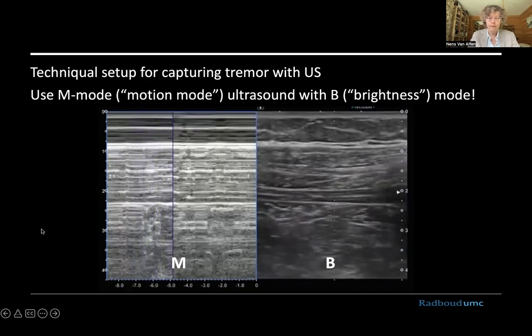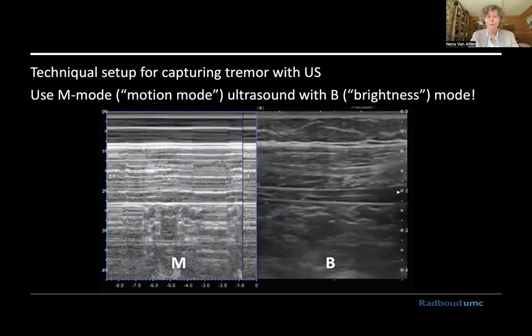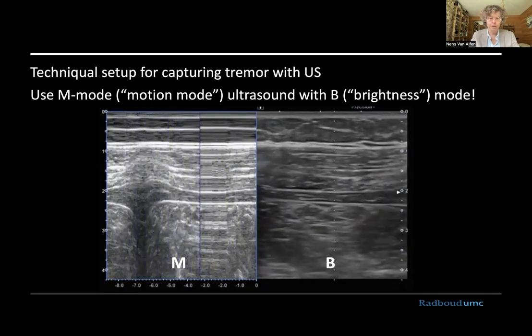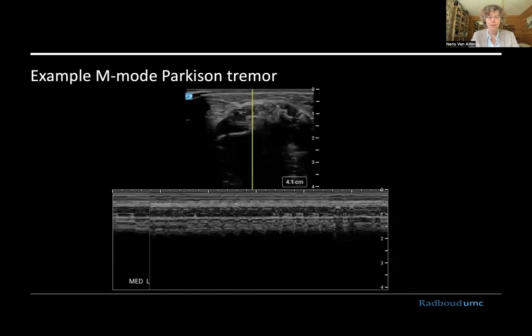Here are some measurements being performed, and we're going to see what that M line results in. So here again, you see the B mode image on the right, you see the M mode image, which is also called the beach with the sand, on the left. And if the patient breathes in, you can see the diaphragm coming into the picture. Okay, but we're not looking at diaphragms here, we're looking at tremor. So this is a still image of an M mode of someone with Parkinson's. And in the M mode, you can actually see the frequency of the muscles moving, right? So that's this line below here that can capture the frequency of tissue movement for you.